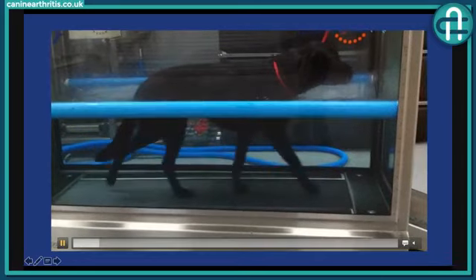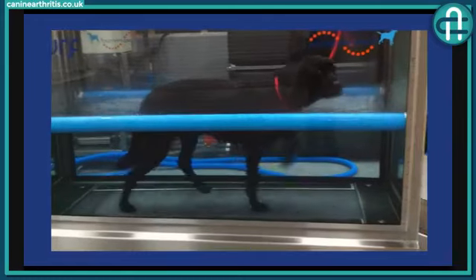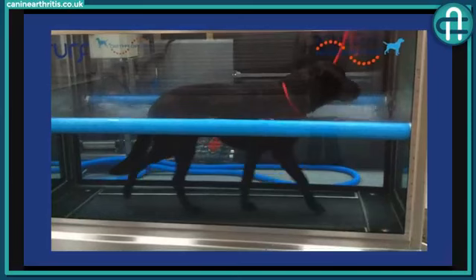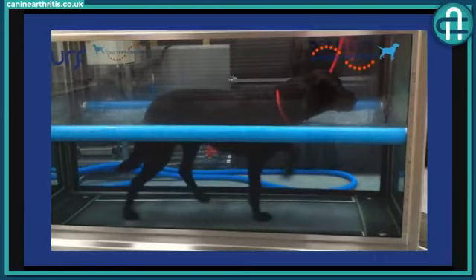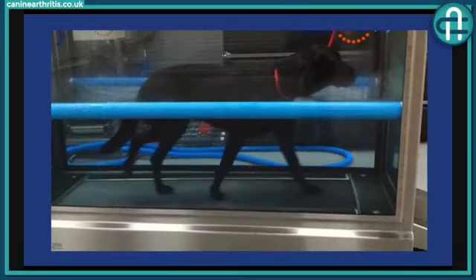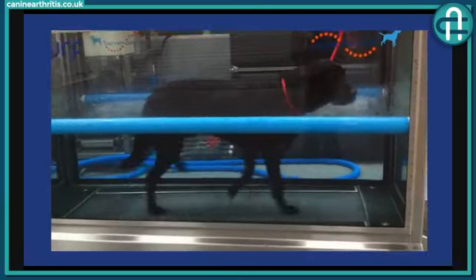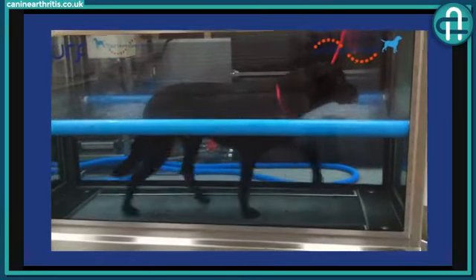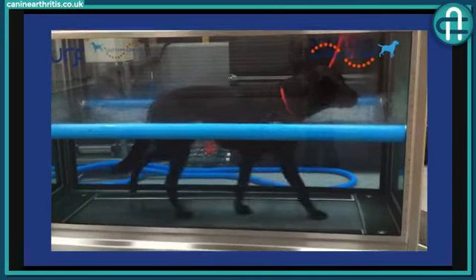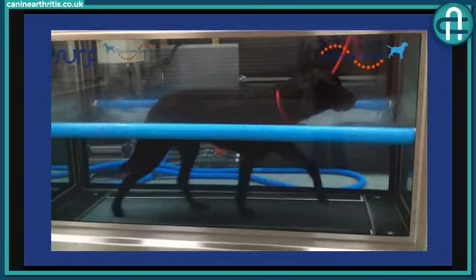Let's have a little look. So yes, you're right. The swing phase, we describe that as the swing phase. So he is picking that left up higher. Now, whether it's the buoyancy, it was his left stifle. He had a complete stifle disruption, and stifle, for those that aren't familiar, is the knee. He had a disruption of the stifle, which he required this for. But he's obviously restoring his range of motion very quickly in that one.